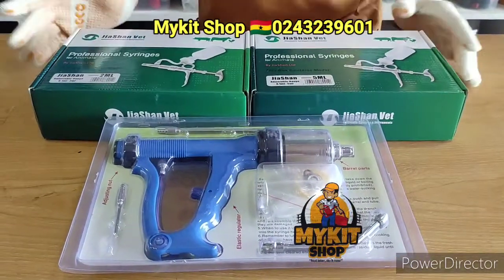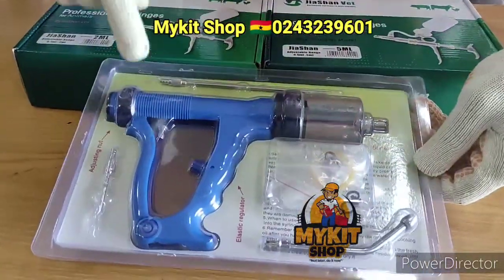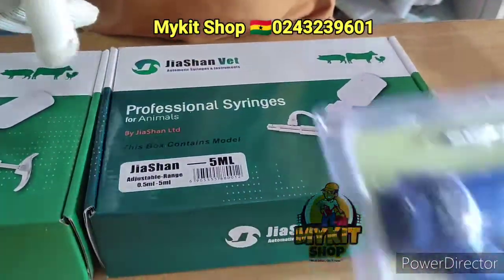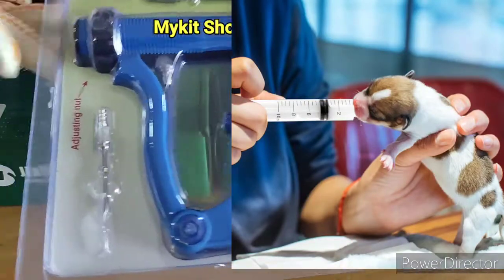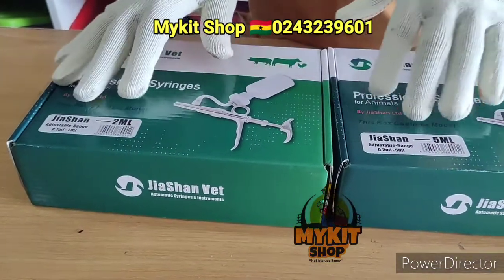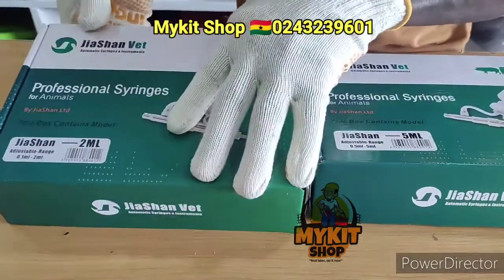Welcome to Market Videos. I want to show you the various automatic syringes we have. We have the 50ml, the 2ml, and the 5ml. The 50ml is mostly used for feeding animals, the 2ml is for poultry farmers, and the 5ml is for all-round use with all livestock. They are all adjustable.